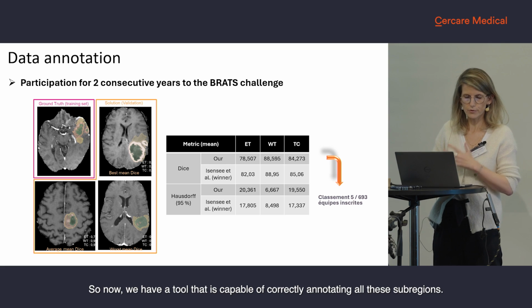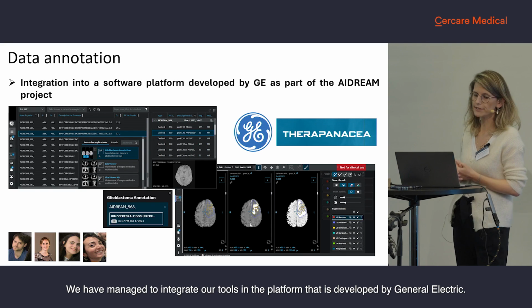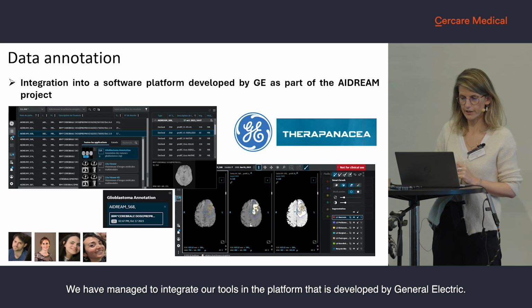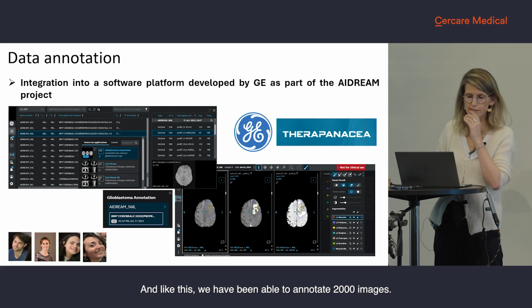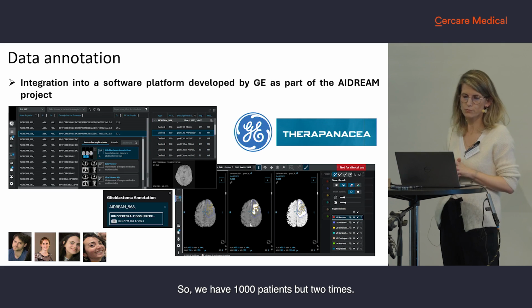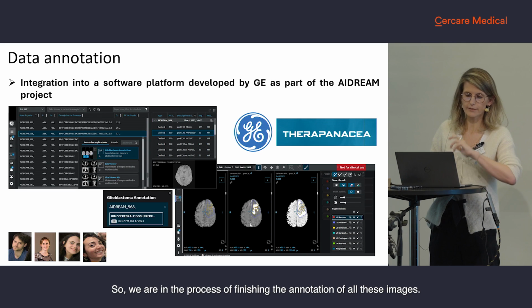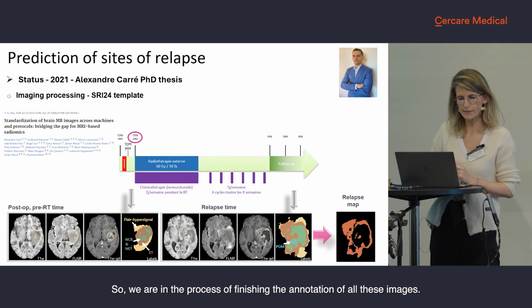So we now have a tool that is capable of correctly annotating all these subregions, and we have managed to integrate our tools in the platform that is developed by General Electric. And like this, we have been able to annotate 2,000 images. So we have 1,000 patients, but 2 times. So we are in the process of finishing the annotation of all these images.